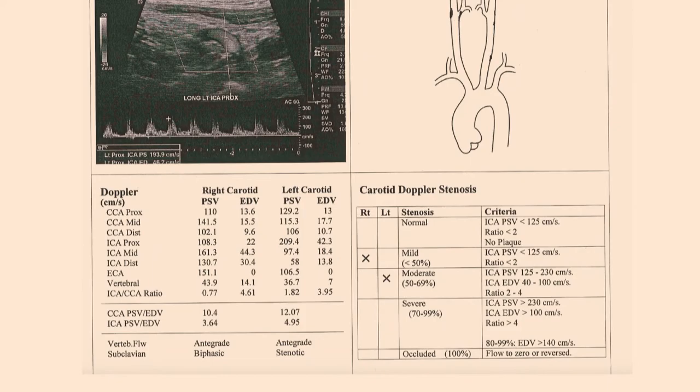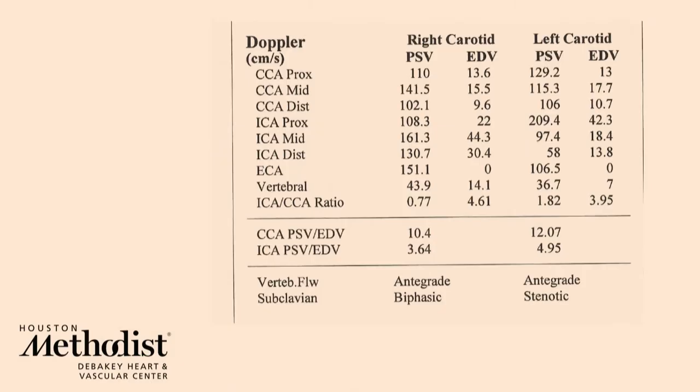But go back. I want me and the audience to understand your thought process in looking at it. So we establish, you look at the common carotid, you just have to find whether that's within the normal velocity range. Then you start looking up to the ICA. Why do we look at the ECA? I've never really figured out why I care about the ECA. Well, the ECA becomes really, really important when you have any ICA disease, because the ECA provides you collaterals.